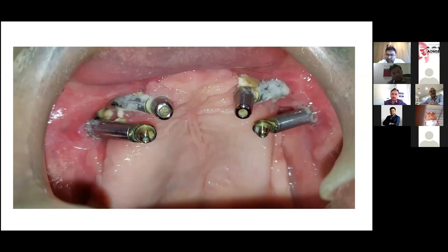So they have to remove the leg every day, or maybe some days, to actually release the tissue tension on the knee. In the same way, when they remove it, you have to clean it. Unless you clean it, the soft tissue is going to give way. This is what we have to explain to the patient: this is not natural rehabilitation. It's a prosthetic, you have to take care of it. So I don't think there should be a problem with this long one. I have one patient, in the first two PSI cases, where we have the long PSI stud coming outside, but they are not creating a problem.